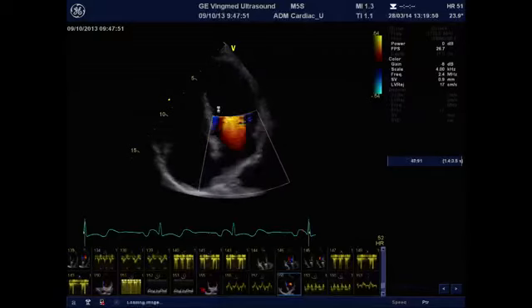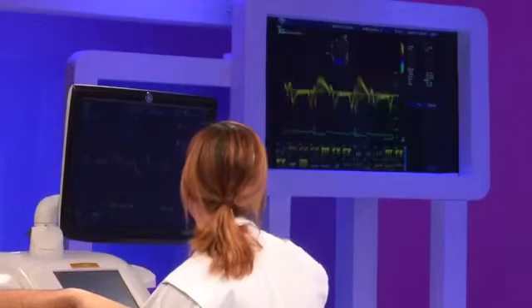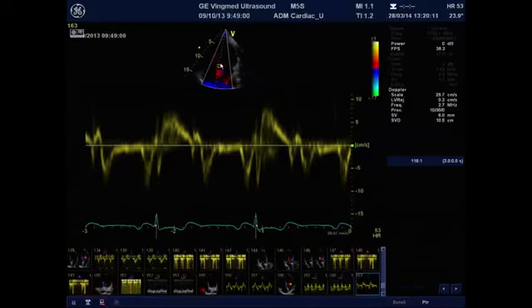You should assess the diastolic inflow pattern at the mitral leaflet tips, just like this with the pulse Doppler, and you should measure the E and the A wave and the deceleration time, and also using the pulse wave Doppler at the mitral annulus at the septal and the lateral with the tissue Doppler imaging.